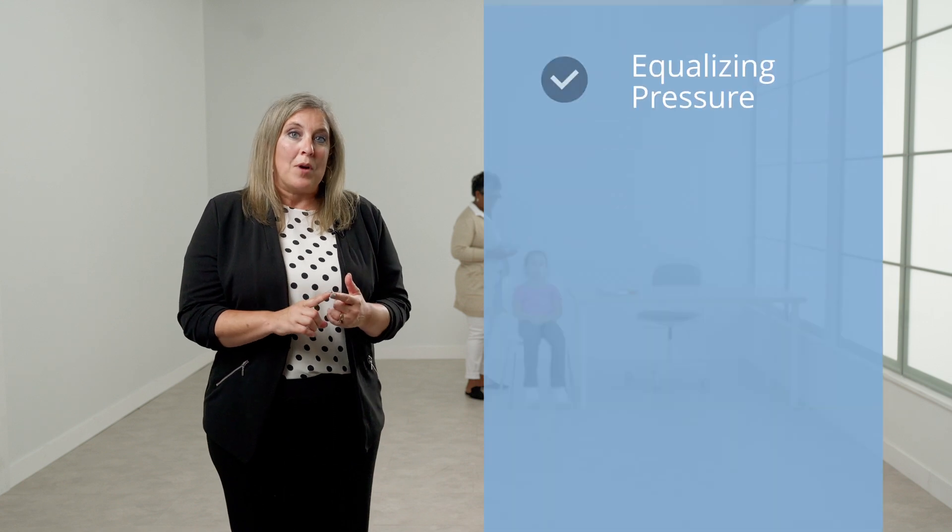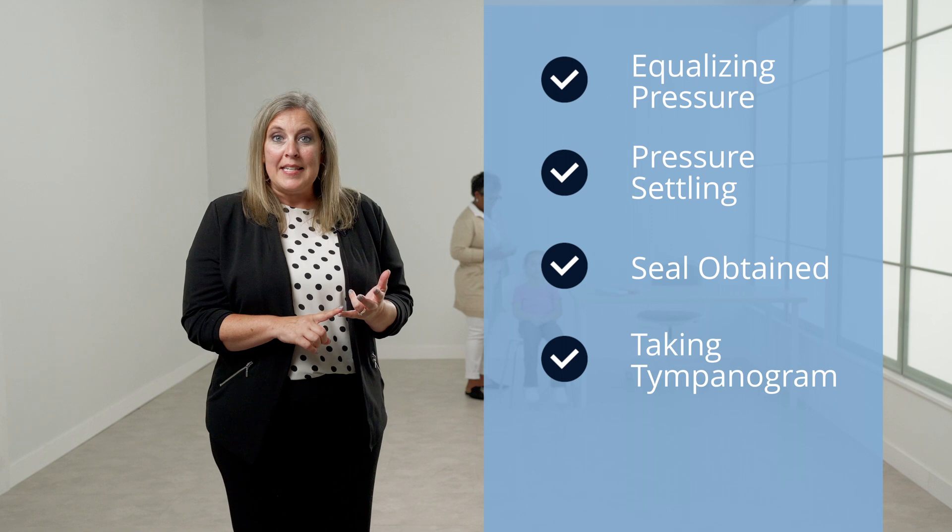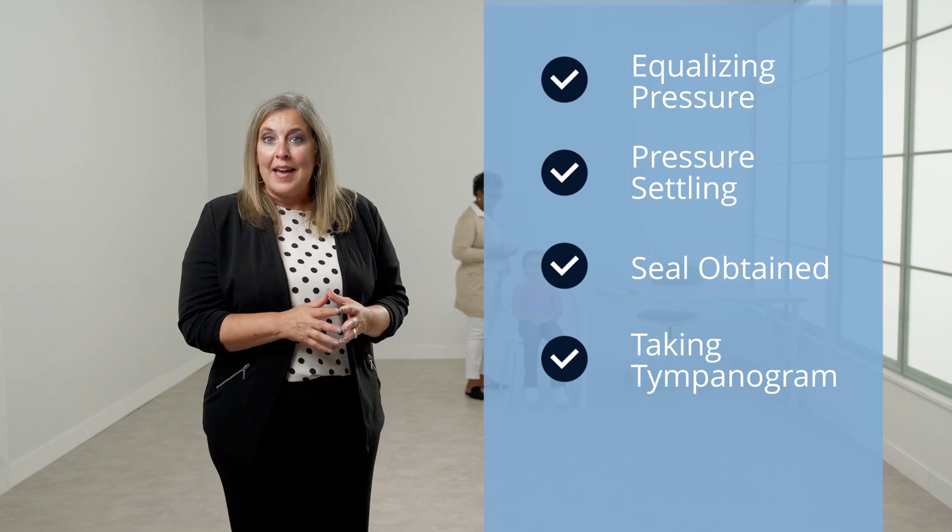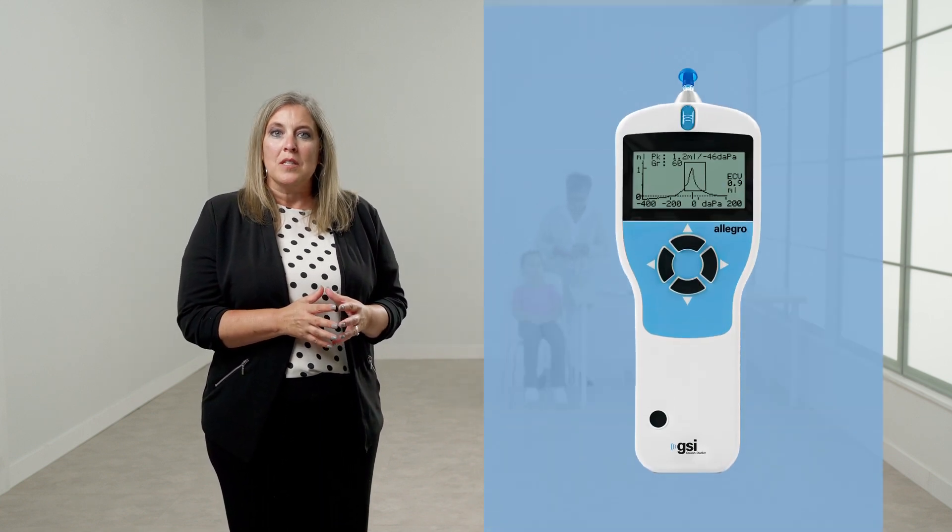These include equalizing pressure, pressure settling, seal obtained, taking tympanogram, and if selected, seeking Ipsy Reflex. When the measurement is complete, you will be prompted to withdraw the probe and the tympanogram will be displayed.